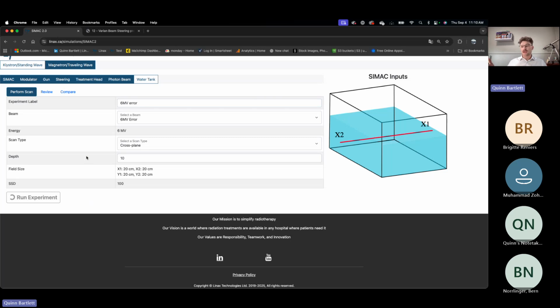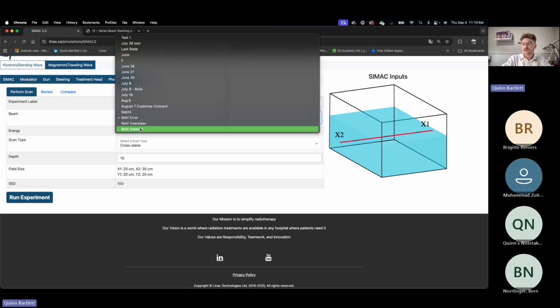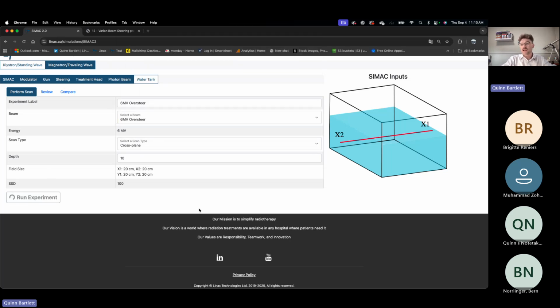We'll then be able to overlay them, and it's just a nice end result to see we went through this and we oversteered it and then we corrected it. Then we'll call our 6MV oversteer, and we'll grab our oversteered one. We'll do it at the same depth just so that we're looking at data in the same spot. Of course, you could do multiple depths, or a different depth, more of your Dmax or values that would be more useful to investigate. Or maybe you could do your 10 and then your 20, and you could get 10/20 values. And so we ran our oversteer, and then we'll run what did we call the last one? Was it just steered? Yeah, and then we'll run our steered.